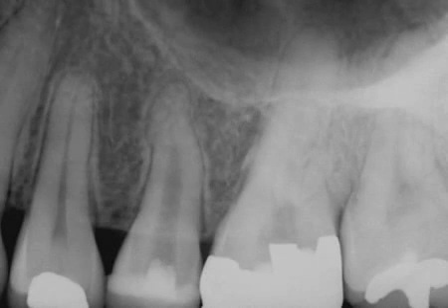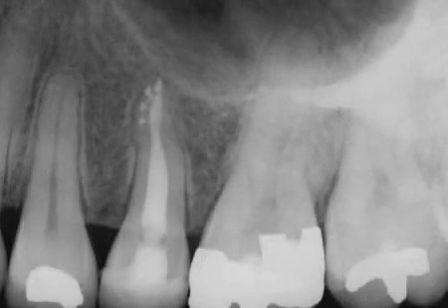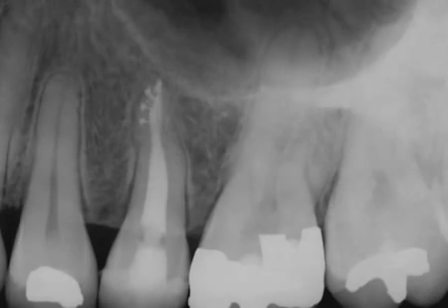Here's a preoperative radiograph of a maxillary left second bicuspid. Notice the canal has been pre-enlarged in its coronal 2/3. Using the techniques we just saw and a little bit of patience, I negotiated the block and discovered the canal divided apically. The postoperative radiograph demonstrates that the canal bifurcated deep and there are 4 apical portals of exit.